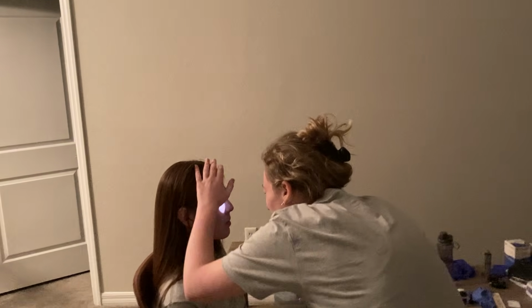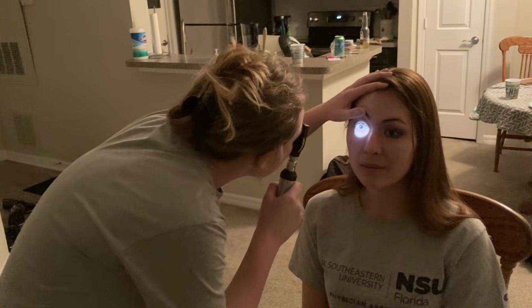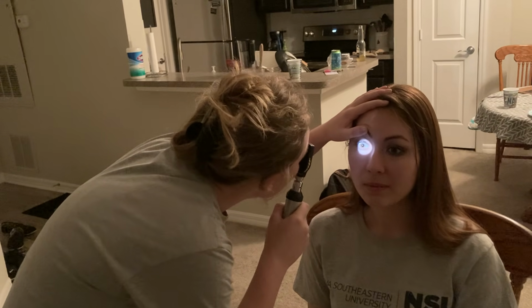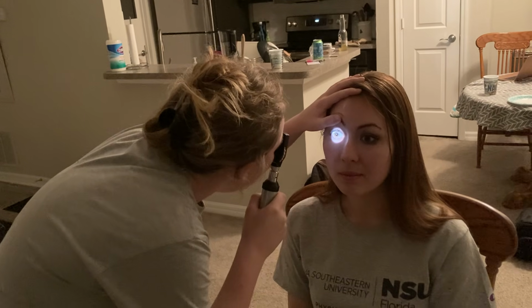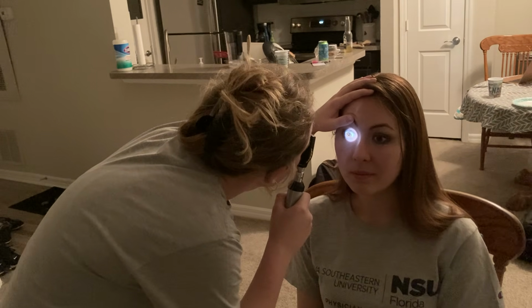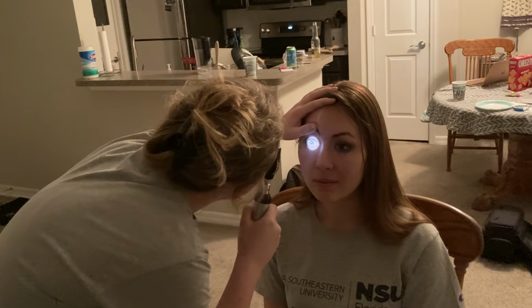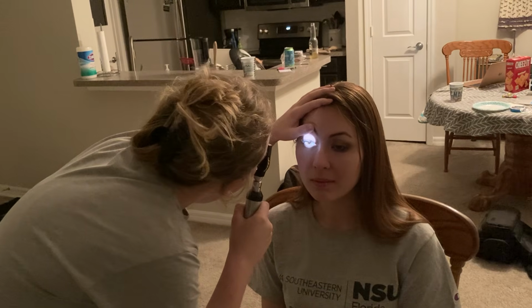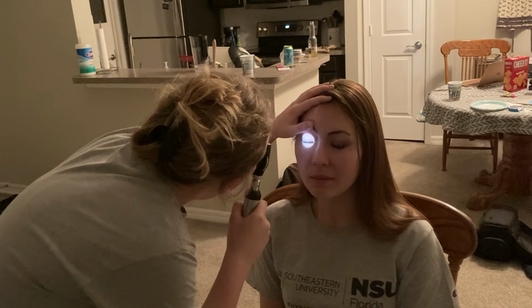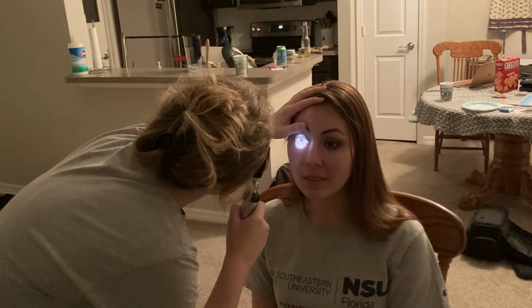Okay. All right. So red reflex is present, and I see that the cornea, anterior chamber, the lens, and the vitreous are clear. And then it's bringing me to the optic disc. The optic disc is orange. It has very clear margins, and the cup to disc ratio is 0.5.